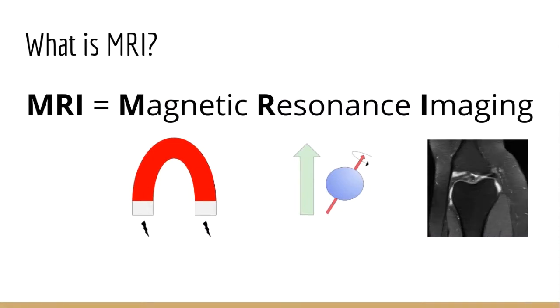And what it stands for is magnetic resonance imaging. So indeed, in MRI, we're trying to probe, to image soft tissues. And so we do not directly take a photography of it. We use a physical phenomenon called resonance.